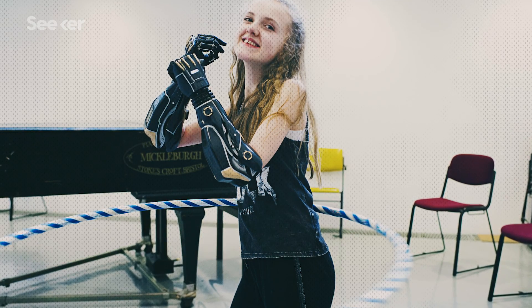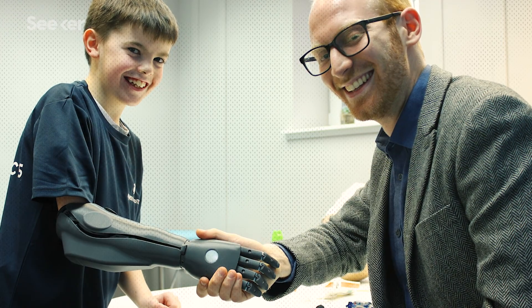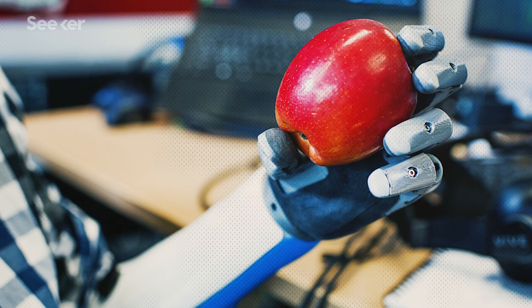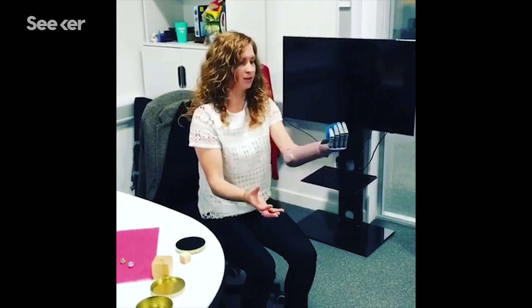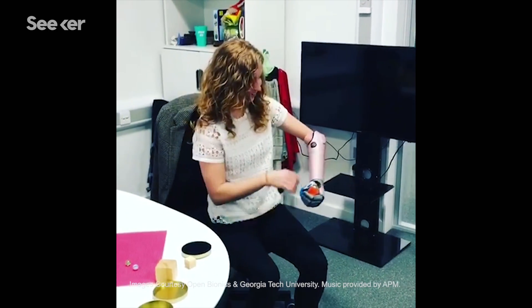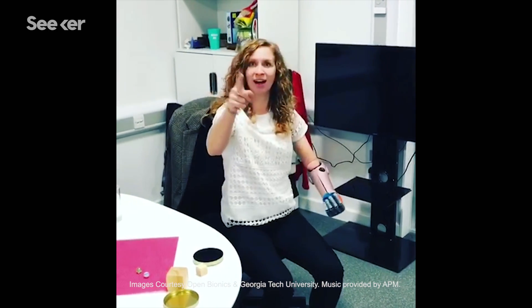Seeing these kids like Tilly and Cameron wearing their arms really warms my heart, because as a kid I dreamt of something like that and now it's reality — it's just overwhelming because I can't believe I'm part of it. 'Is it in position?' 'Yeah!' 'Oh my god, I've never caught a ball with this one before!' 'I'll juggle it — did you get that on camera?' 'I did indeed.'